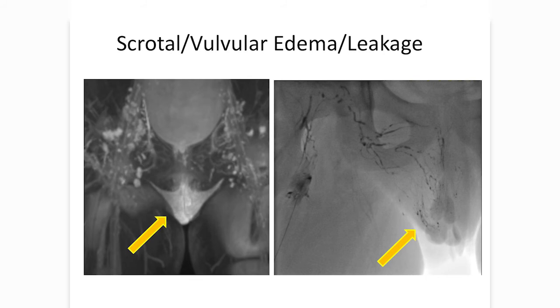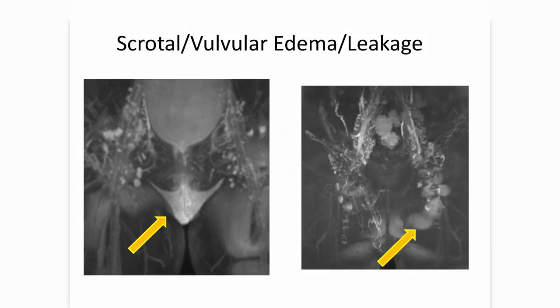We have 4 patients right now treated successfully, and we believe that most of the scrotal edema is not obstruction. It's more reversed flow of the lymphatic system from the leg or from the abdomen into the inguinal area, and embolization of these pathways can reduce the symptoms.